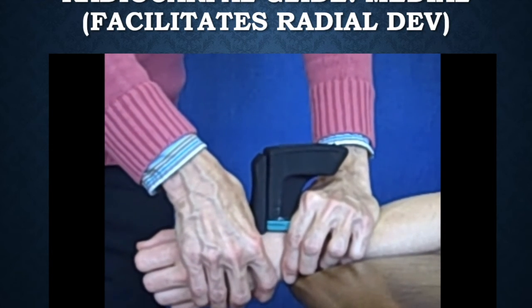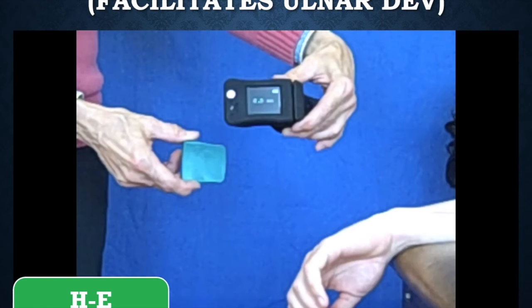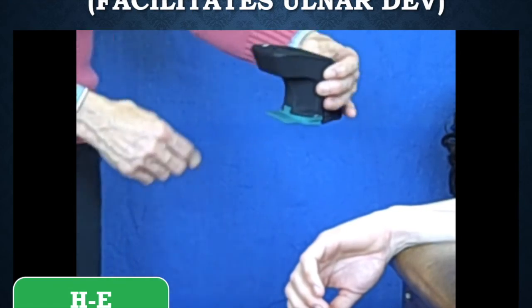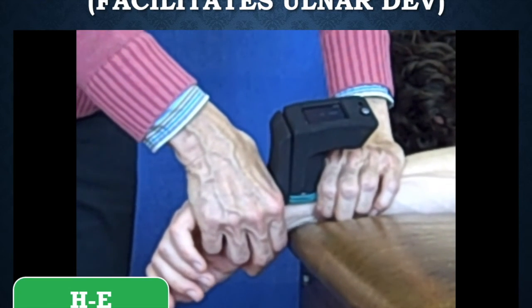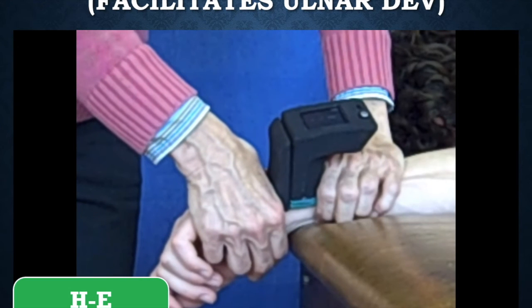Again, all of the techniques with the Mobil-Aider are the same as your regular anatomic techniques, your regular joint mobilization techniques. You're just interfacing the device in between the clinician's hands and the patient. So now you have an ulnar glide. Or, excuse me, a lateral glide for ulnar deviation. I misspoke there. It's a lateral glide for ulnar deviation.